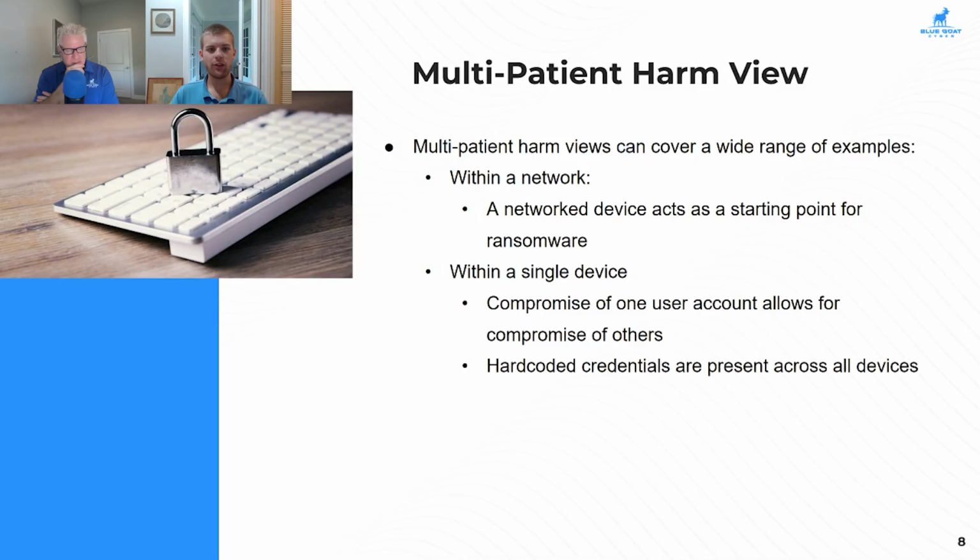A hard-coded credential is something baked into the code where there's a password or a key used to authenticate into some service or some account. And if that is compromised, it can often be applicable across all of the same device if it's been hard-coded. So that would be an example of hack into one device, hack into all of them. The same product by the same manufacturer.